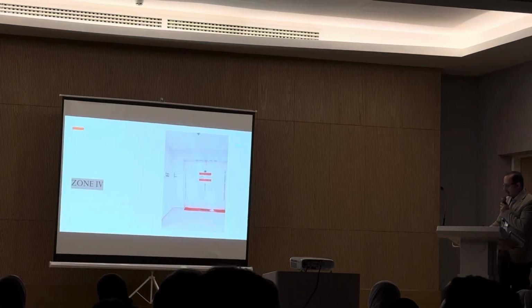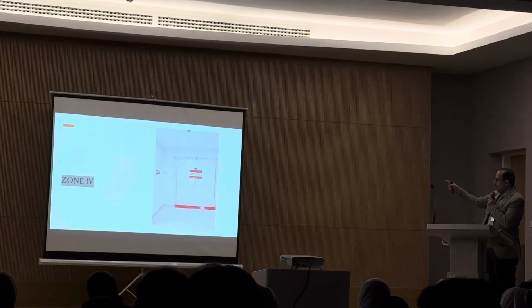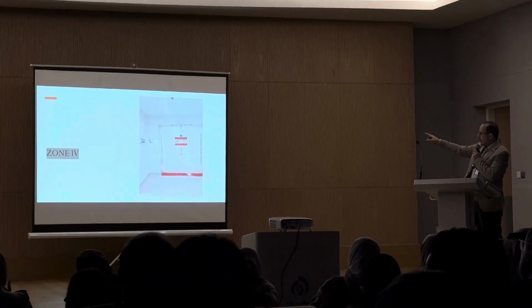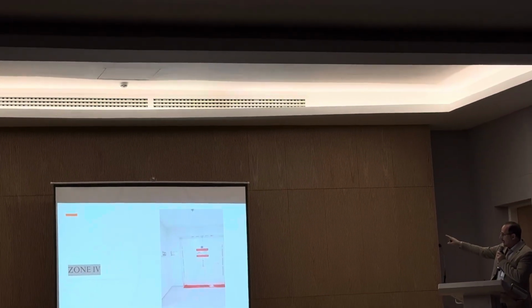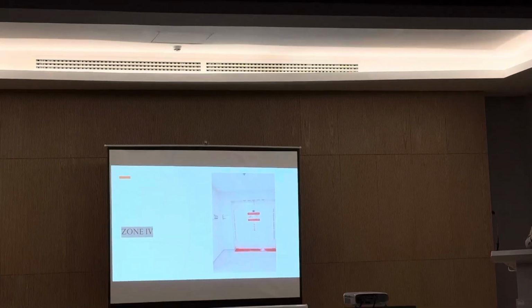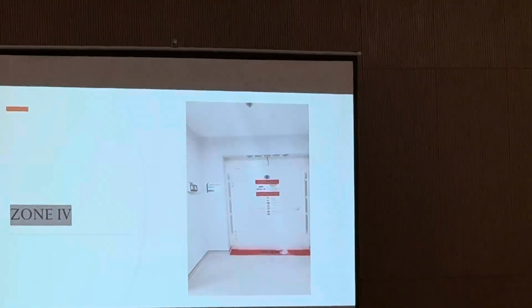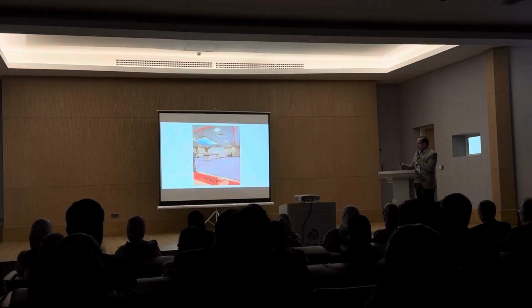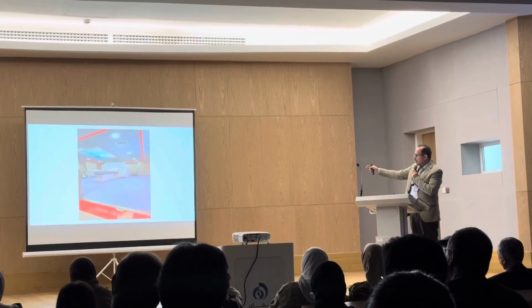This is the inlet or door of zone 4, where we see the signs fully listed on the door, and we have an extra electronic detector and alarming device. If we forget by mistake to detect something small, not harmful, it will show up and draw our attention to that area. This is our MRI machine, which is in the room area, and it is called zone 4.